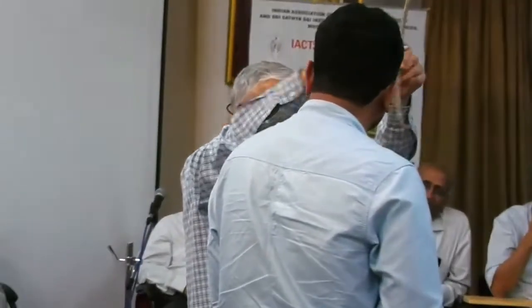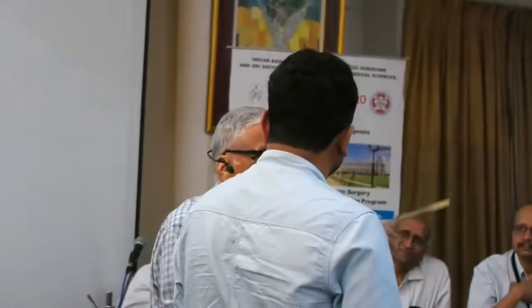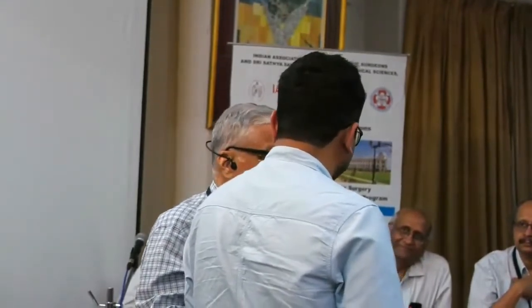Understand? So it happens that the cannula size is wrongly given. So which are the situations where the SVC is smaller than expected? The patient has a left SVC. The cannula is dangling inside. Or a huge SVC, and you feel like telling them that instead of 26, give me 28 or 30. Dilated SVC.